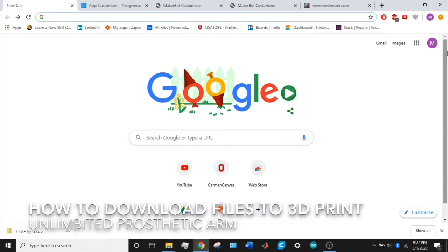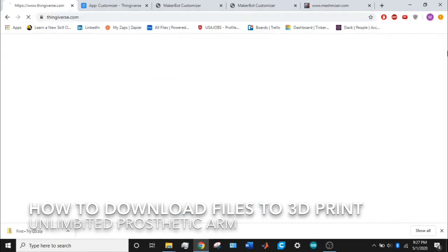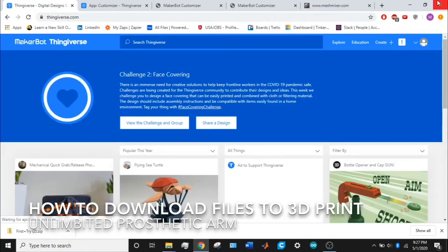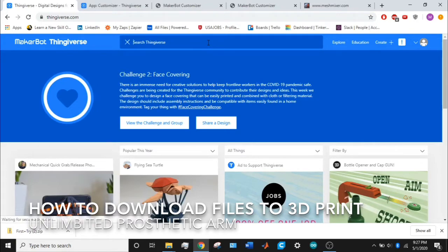I'm going to show you how to download the 3D printing files to 3D print your own unlimited prosthetic arm. First, go into your browser and navigate to thingiverse.com. Once you get there, go into the search bar for Thingiverse and type in unlimited arm, U-N-L-I-M-B-I-T-E-D arm.